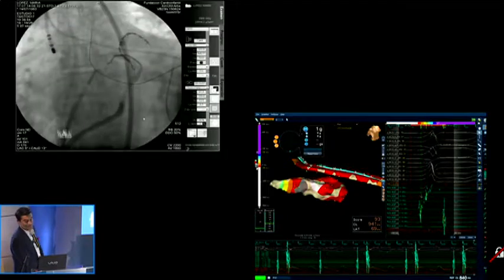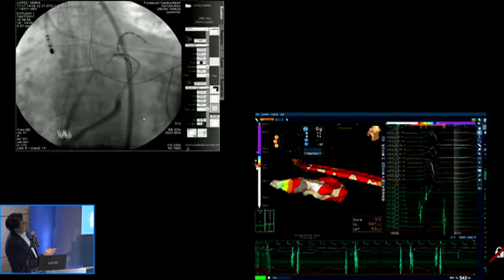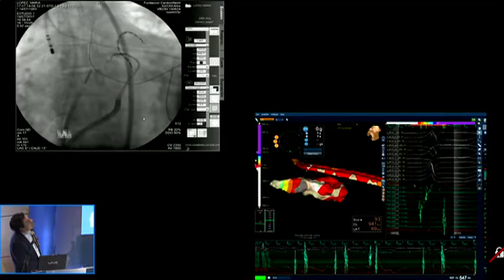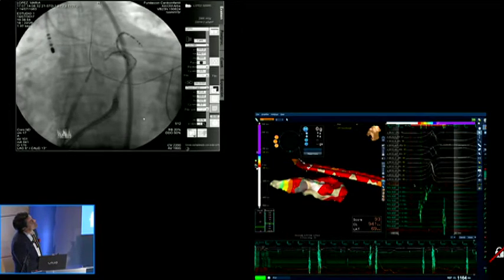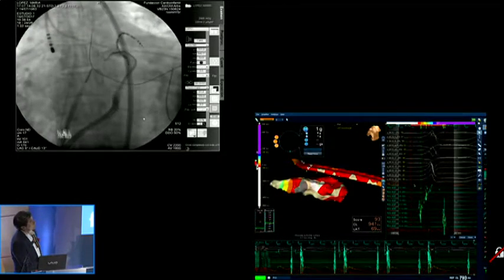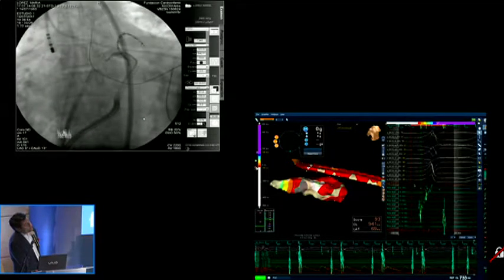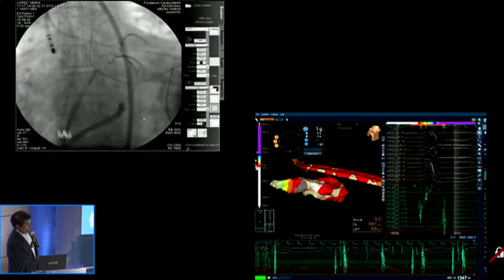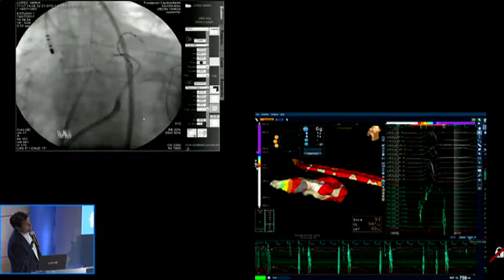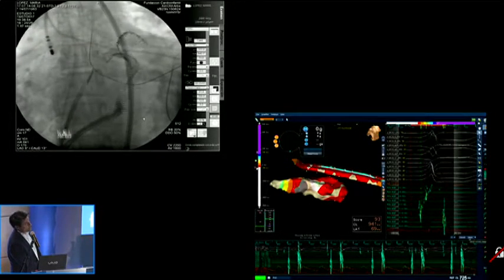Well, the thing is, Luis, look at the venogram that Fermin did. He injected contrast selectively on that vein. We stained the myocardium. I would love to be able to place a balloon and no, the cannula is occluding. Miguel, can you do a 3D reconstruction from the guide, please? Yes. Yes.